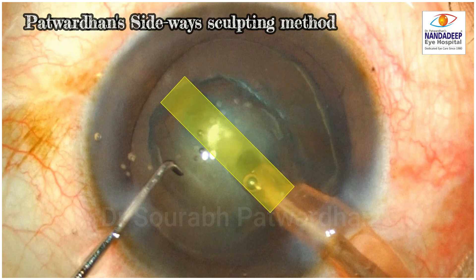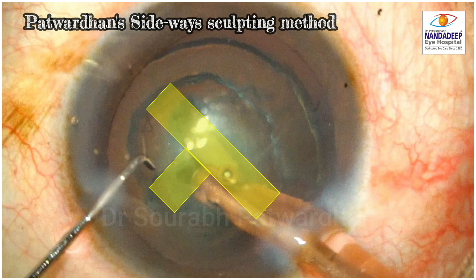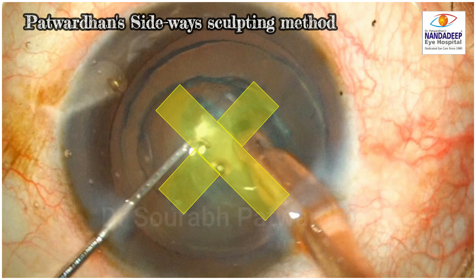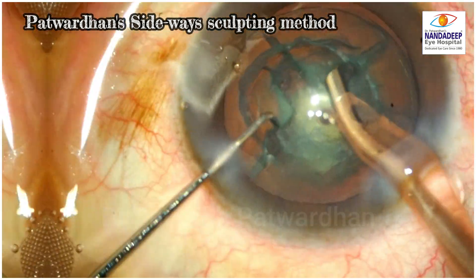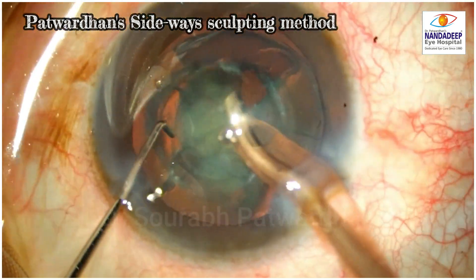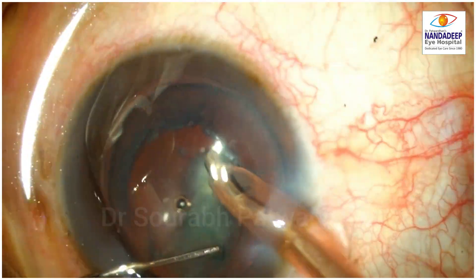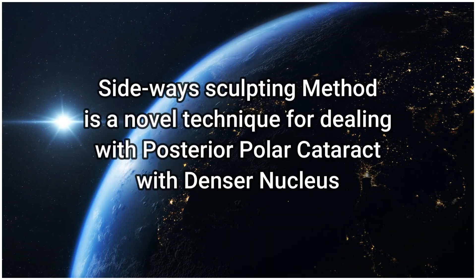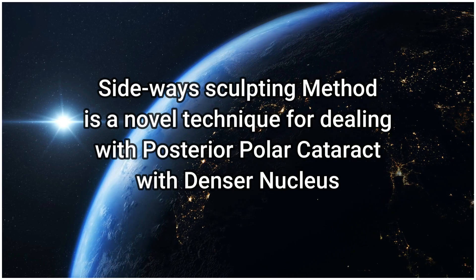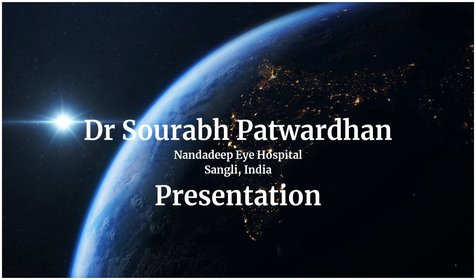The sideways sculpting method involves making a first trench, then a perpendicular trench without rotation of the nucleus, giving four quadrants that are gently separated and emulsified without requiring rotation or excessive stretch on the posterior capsule. The sideways sculpting method is a novel technique for dealing with posterior polar cataract, particularly denser nuclei. I am sure it will help you in managing posterior polar cataracts. Thank you.